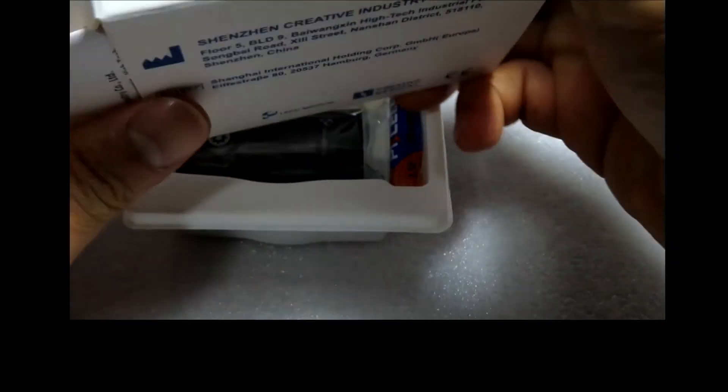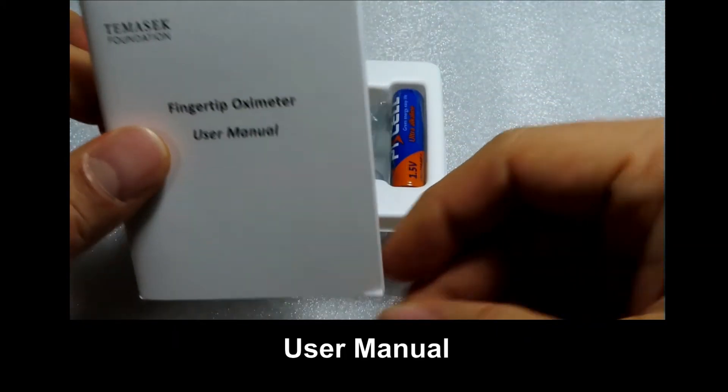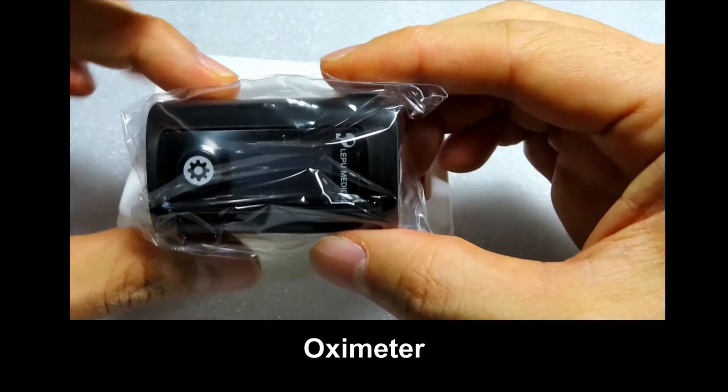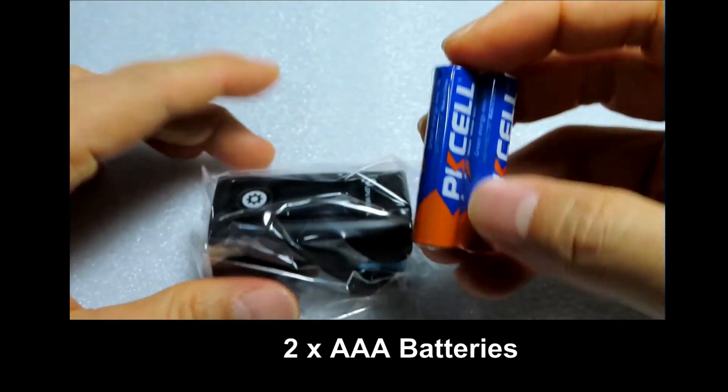So inside this box, there is a fingertip oximeter, a user manual, the oximeter itself, and it comes with a set of batteries.